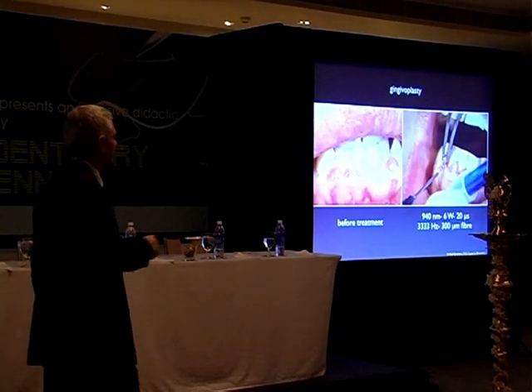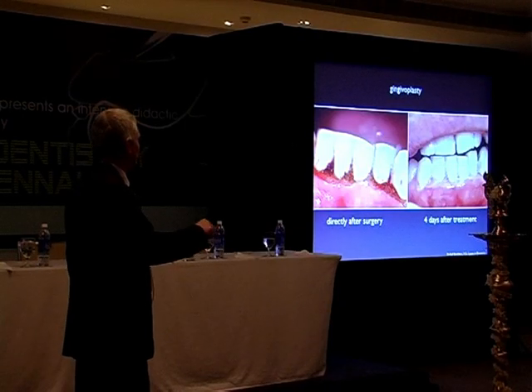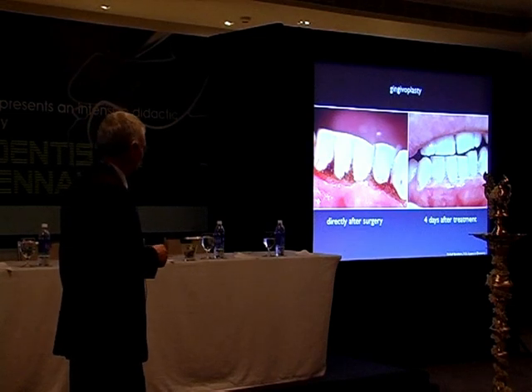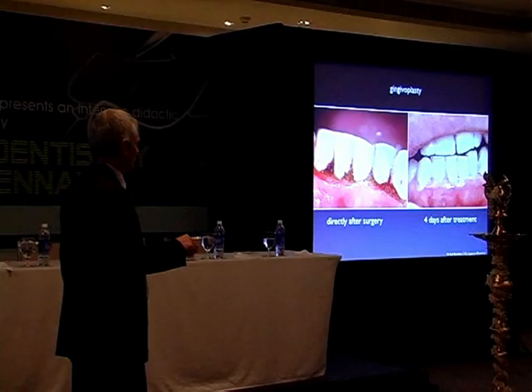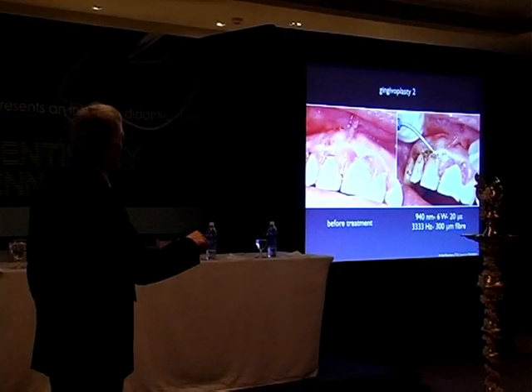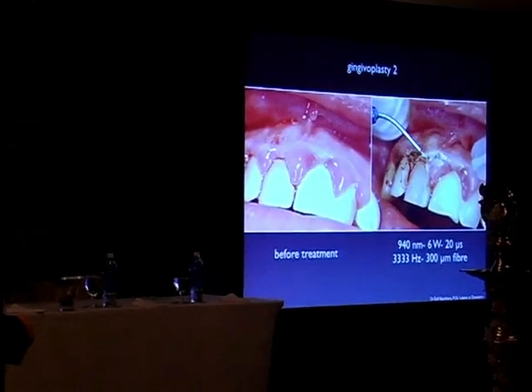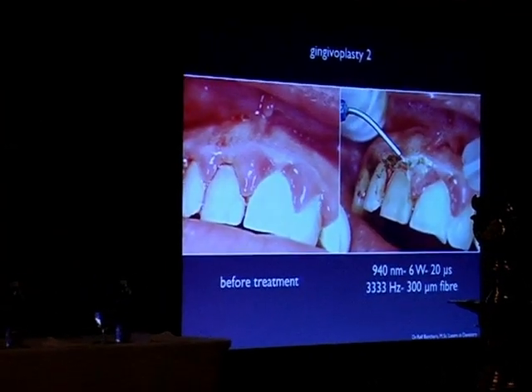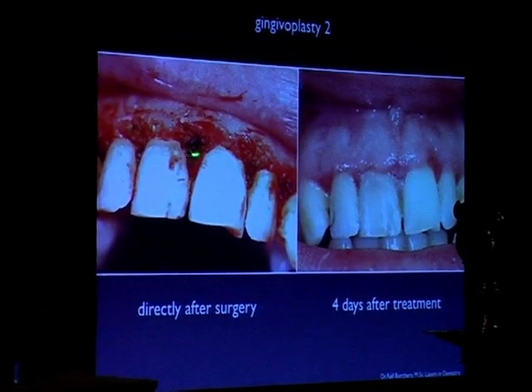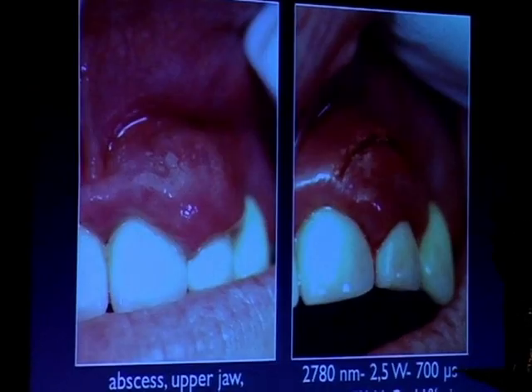Gingivoplasty, you can do it by diode laser, as you see here with a 940 diode laser, directly after surgery. And because of the very good vascularization, there is minimal bleeding afterwards. This is 4 days after treatment. Next case in the upper jaw, and in these severe situations, you will have a little bit of bleeding. As you can see here, this is the carbonization and the coagulation of the little vessels. This is 4 days after treatment.